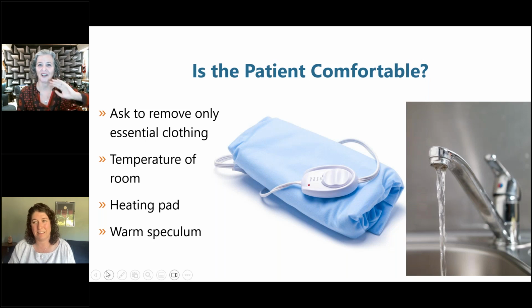And then with all of the changes with policy and OSHA and all the things around heating pads, all of a sudden now we're supposed to be using cold specula. I think that we could always turn the warm water on and just run it under warm water. Take that moment. Somebody will see us.